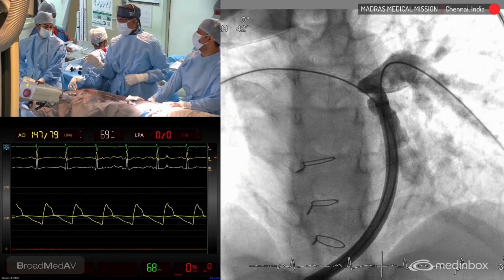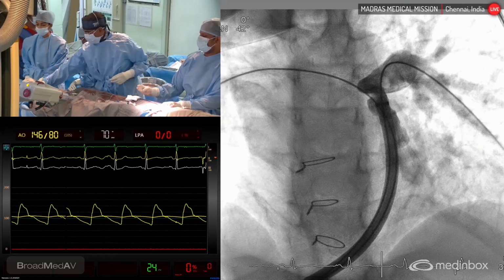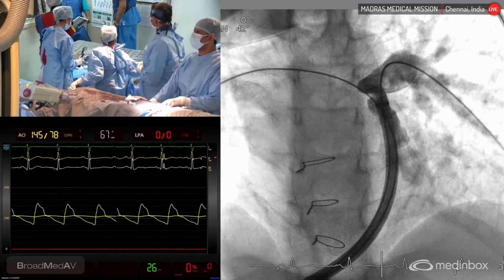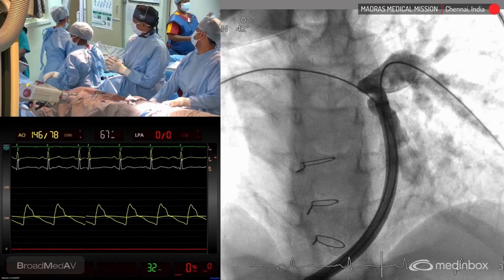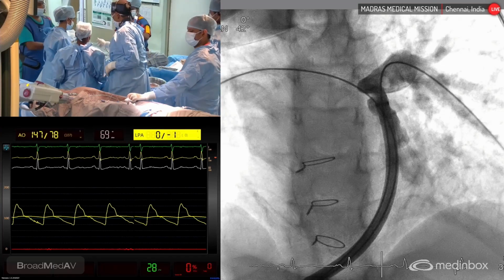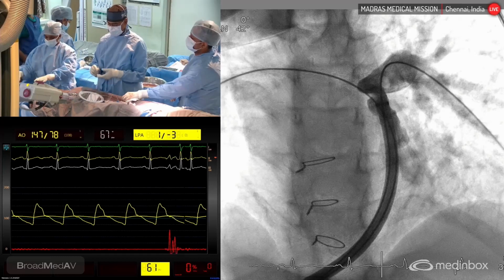So we are going to be mounting two balloons, two Admiral Xtreme 12 by 4. I'll demonstrate the way in which we mount it. This is a 12 millimeter diameter, 4 centimeter balloon. I need two indeflators.